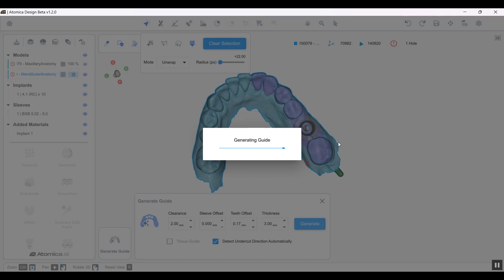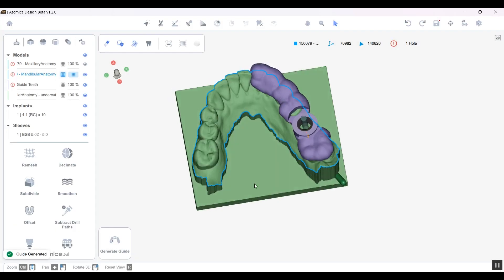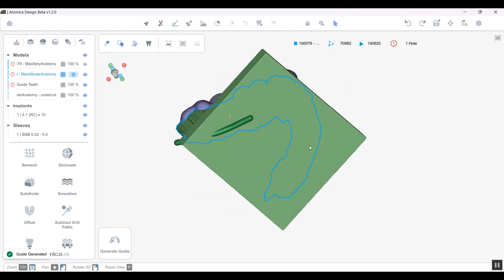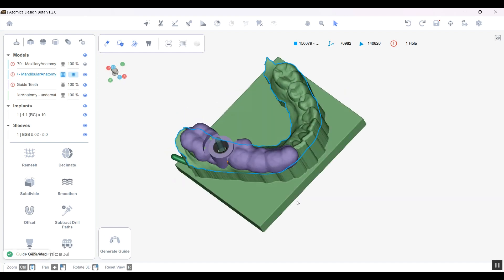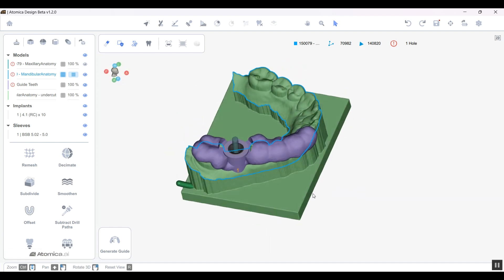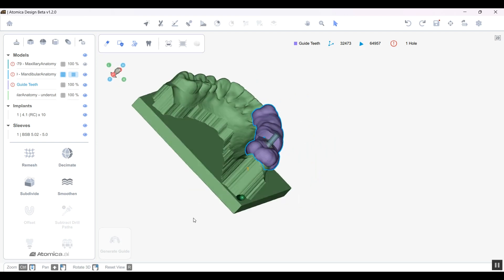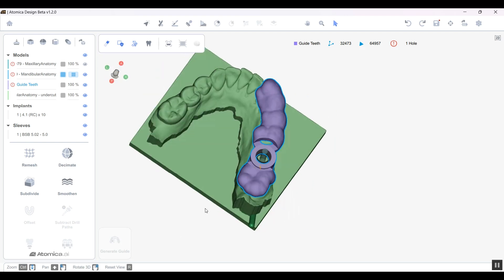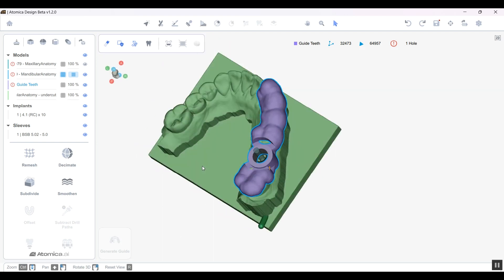A model with the blocked out undercut will be generated along with the surgical guide. This is our surgical guide, and this is our model. Pretty simple, pretty easy, very few simple steps to be followed, and there you go.